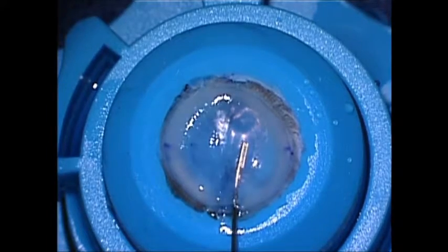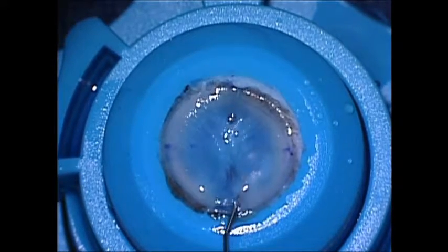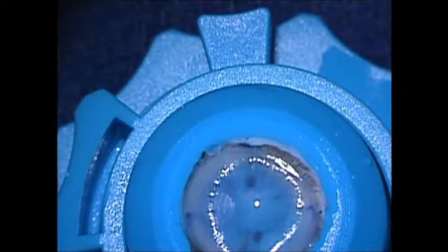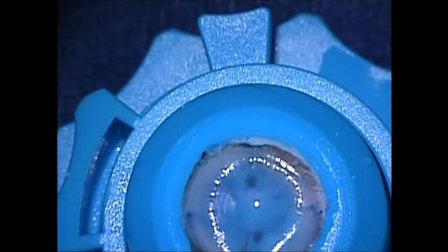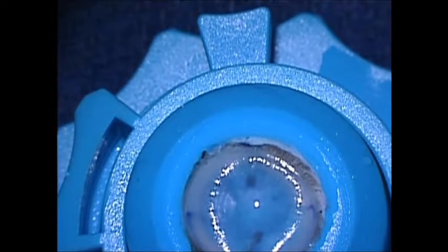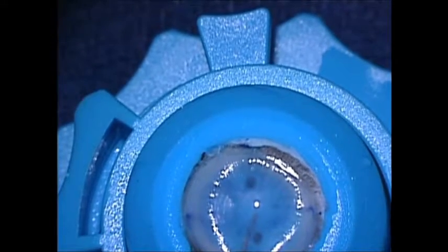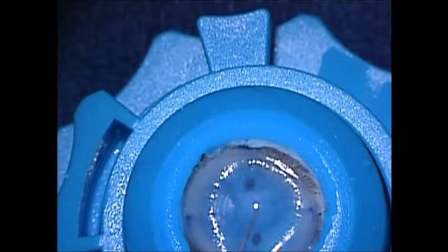This is done through a basic double-cylinder device with an air outlet. The obvious advantages are that the tissue is inserted into the eye and the orientation is known and maintained. It takes all the guesswork, tapping, and difficult steps out of the surgery, making it as easy as an air injection.